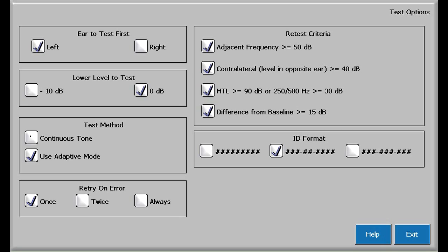Retry on error selection allows the RA800 audiometer to automatically re-instruct the subject on how to take the test if they are having difficulty. I recommend selecting twice.